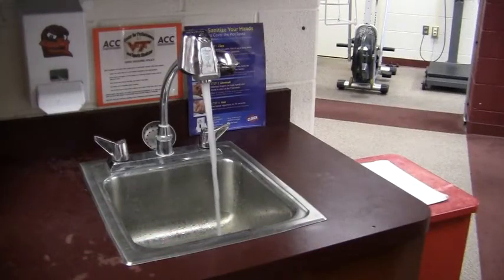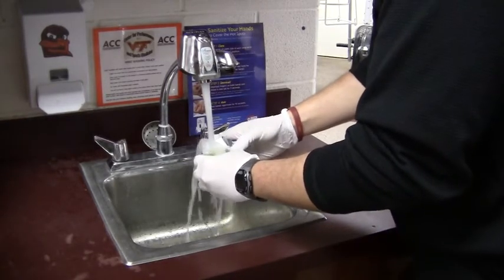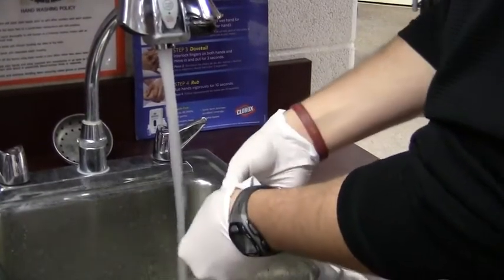The clinician should put both latex gloves on, open up the casting roll, and soak the casting material in water. Be sure to squeeze out any unnecessary or remaining water.